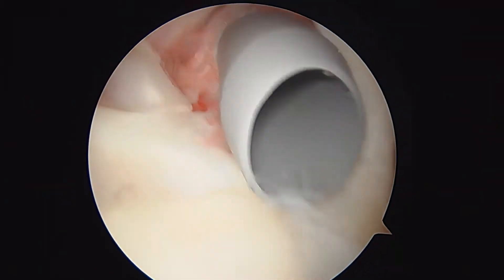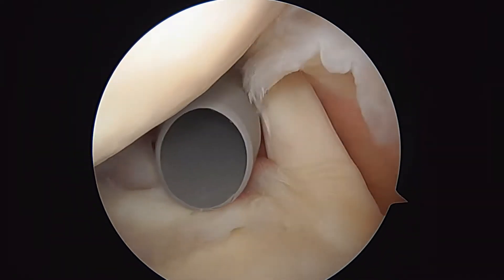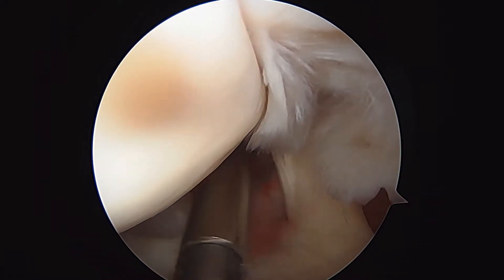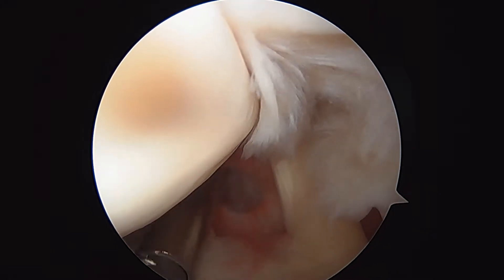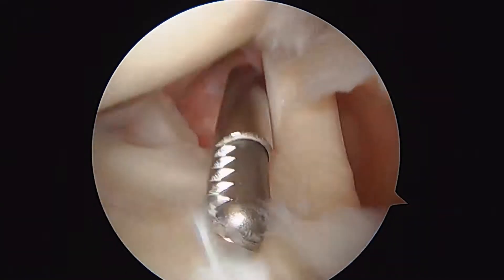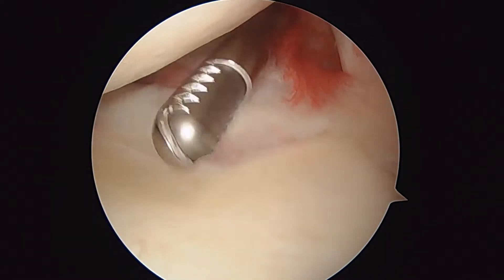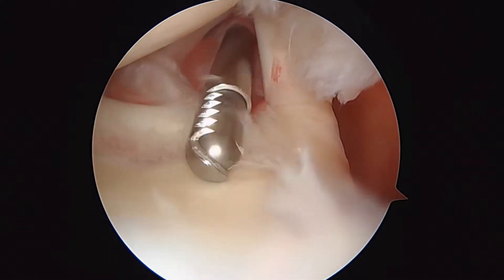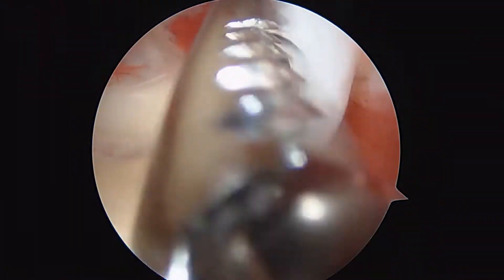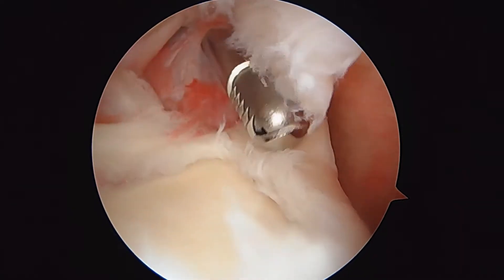We're going to look at the biceps and decide if we have to do anything to it. We're going to take a shaver and evaluate the biceps anchor here and see if it's loose. If it is, we'll do a type of tenodesis that we can show you in just a second. But we have to make the diagnosis first. Here's our shaver — we'll go ahead and turn it on. It has suction attached to it. We're debriding the labrum first, and now we can look at the biceps anchor, which looks okay.